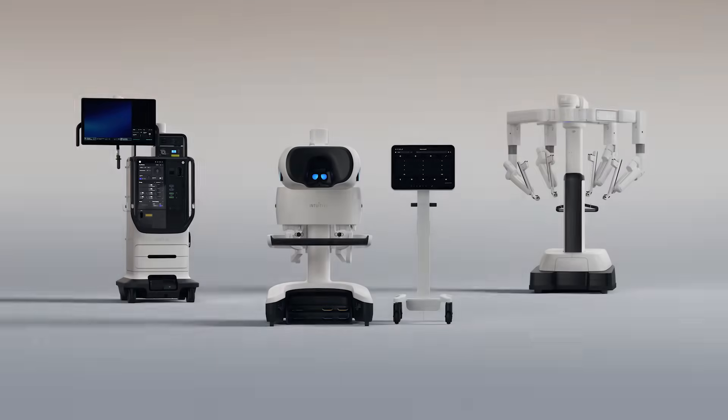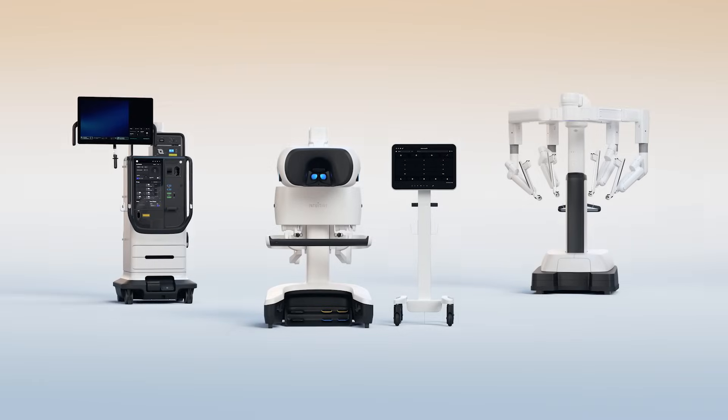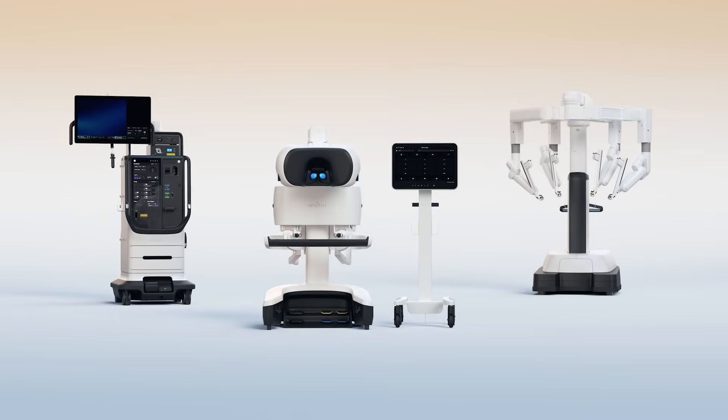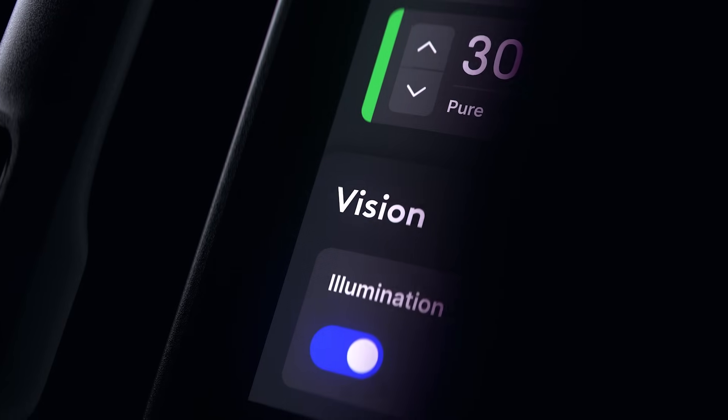Intuitive DaVinci 5 is our most advanced and integrated system ever. It's going to transform surgery for surgeons, care teams, and patients.